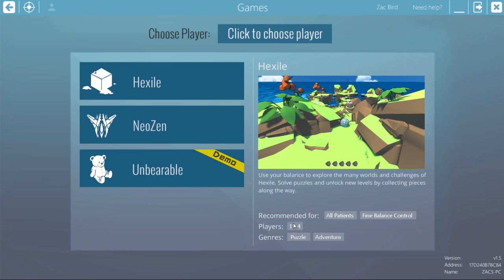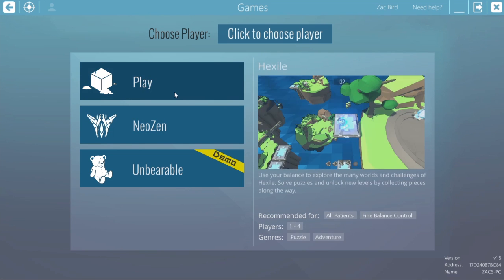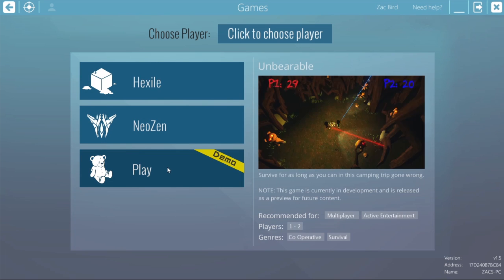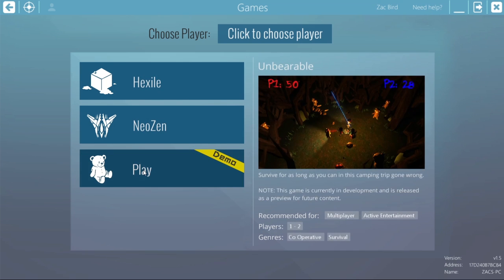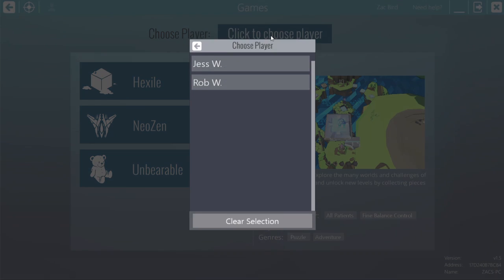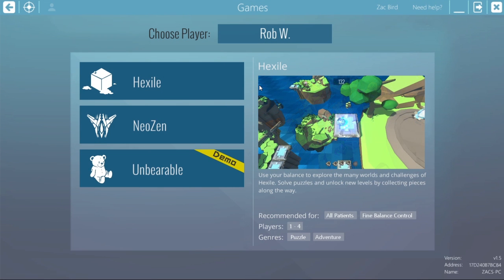We currently offer 3 games: Neozen, a fast-paced racing game; Hexile, a puzzle adventure game; and Unbearable, a survival game which is still in development. To enter a game, simply click on its icon. If you're using the games with a patient, make sure to select the player first to make sure the data is saved to the right account.